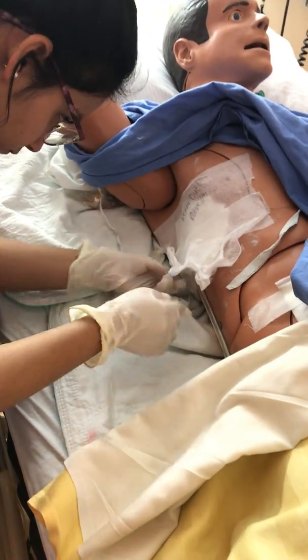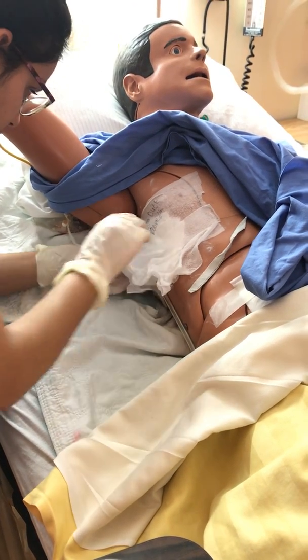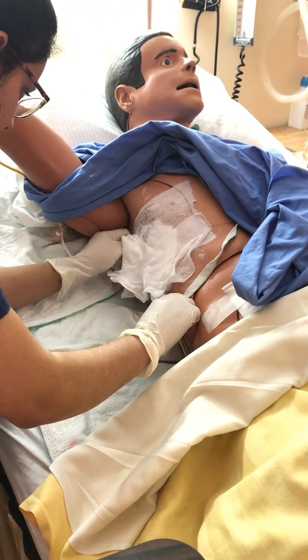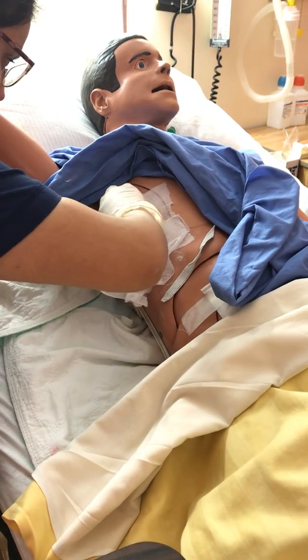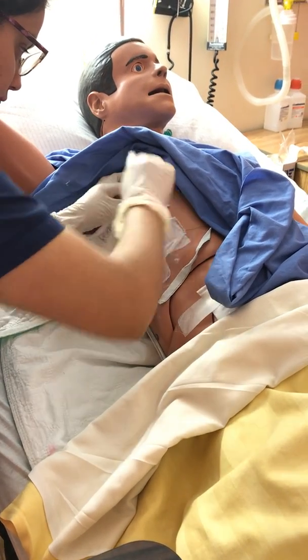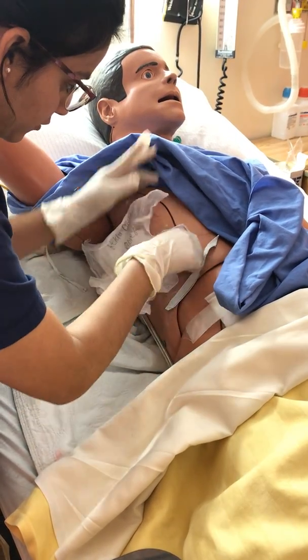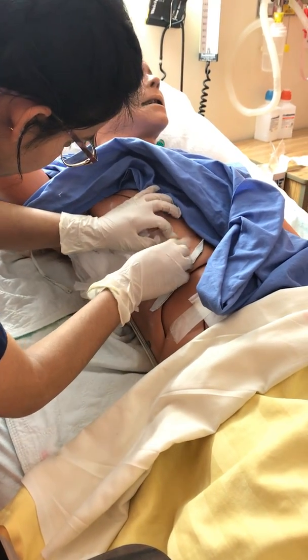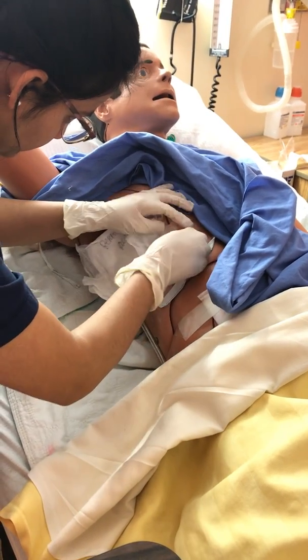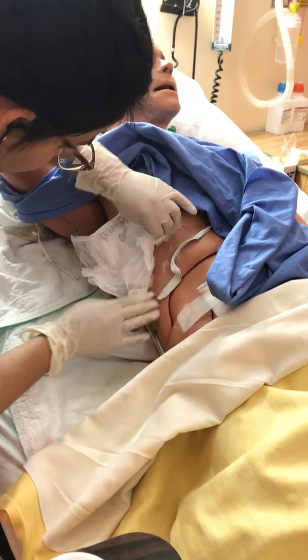And then I'm just going to clean the bigger surface area. And now I'm going to dry. To remain sterile, I'm only going to touch about 5 inches. And you just want to take your time for this procedure, because after all, you're taking this out from a patient. You don't want to go too fast. While I'm inserting, I'm not going to dry suction the chest tube.